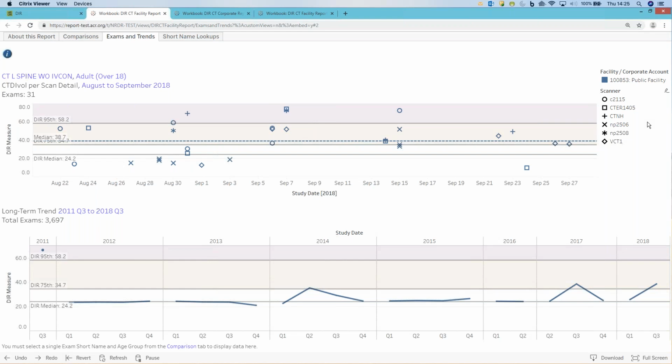You ready for the next one? Yep, go ahead. It says our RSO wants just a very high-level report from us showing how many exams were performed on the CT scanner, and of those, how many exams triggered a high-dose alert, and what was typed in by the tech to bypass the alert, i.e. large patient.